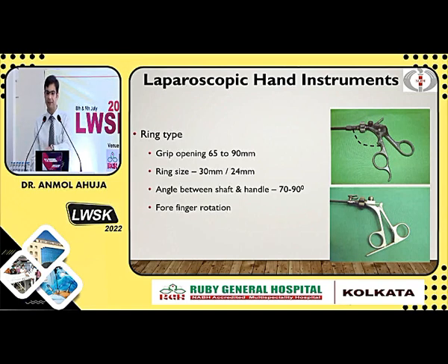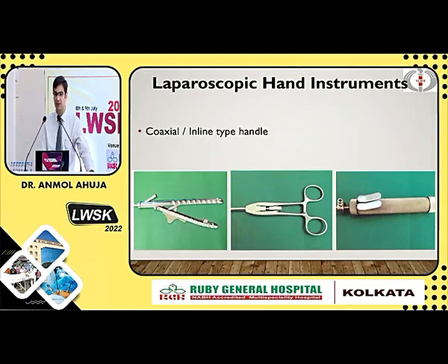Most of the instruments are pistol grip with these grip rings. It is also important to note how you hold the instrument. This will be shown in the OR. Your right hand instrument you can hold with the thumb and finger, but it's not necessary to hold the left hand also with the thumb and finger, because most of these instruments open once you unlock and remove your hand from the handle. So this grip will be much more comfortable as compared to this grip. Always remember that. I think this will be demonstrated in the OR.